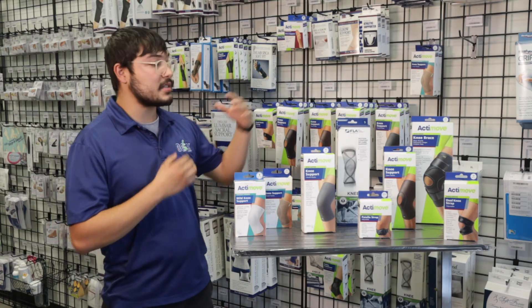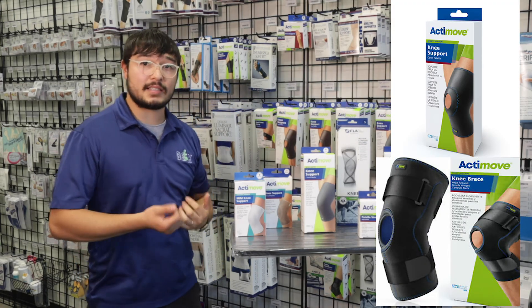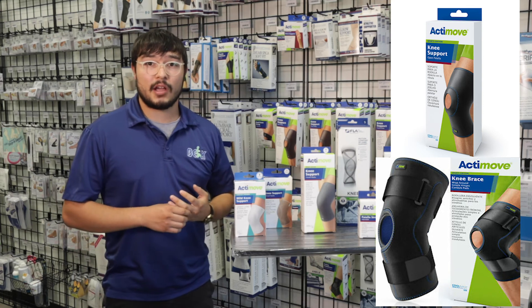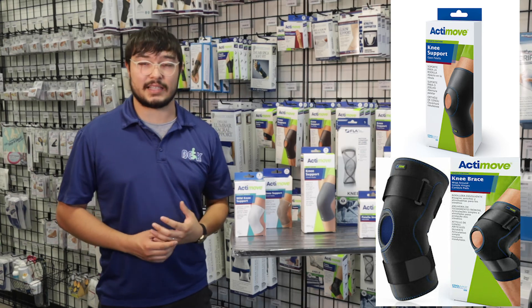When you go to the bigger ones, like the knee support right here and the knee brace that has the Velcro, those are going to be for more serious injuries, like if you tear your ACL, MCL, or meniscus.